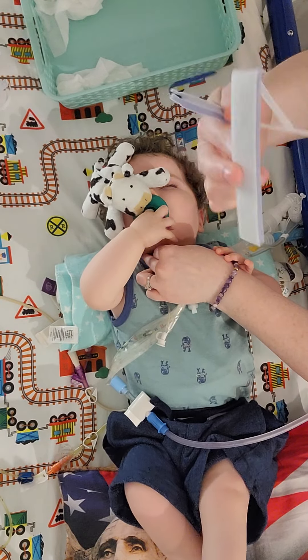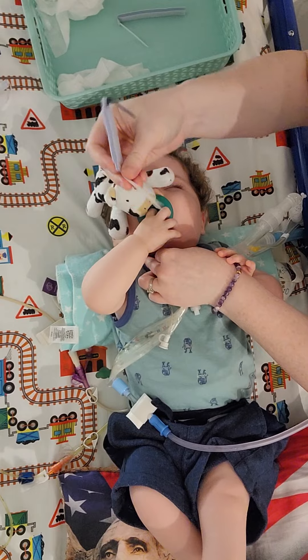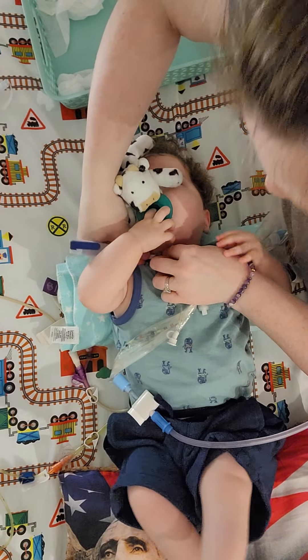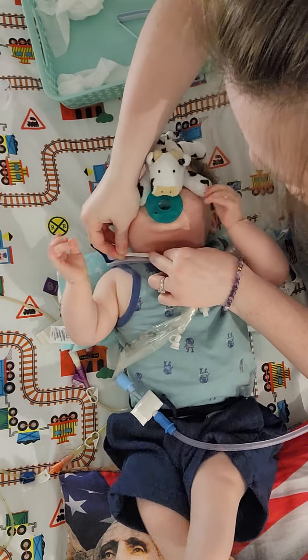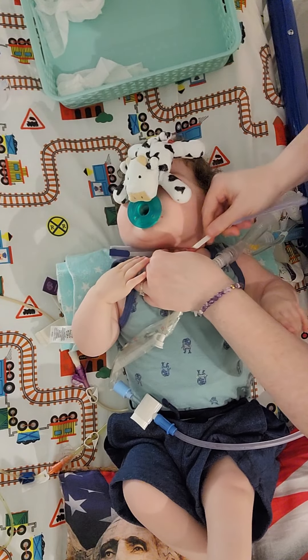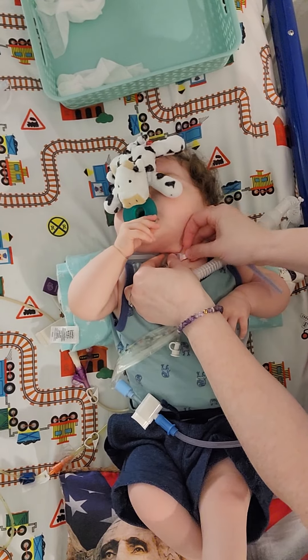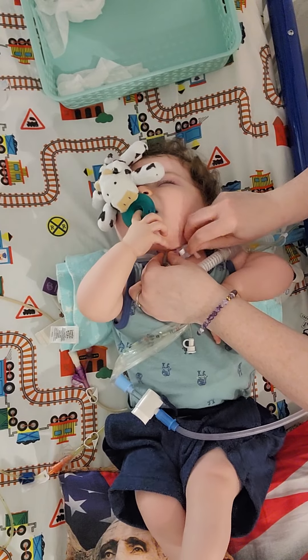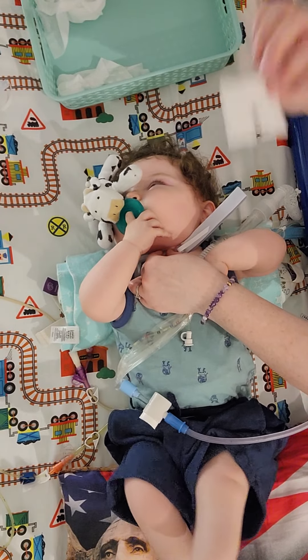Now the tricky part. There are two sides of the trach ties — this is the shorter side that you did not cut. I use Pepper Medical trach ties because they are my favorite; I actually get them from Trach Moms on Facebook because our DME does not supply these. On this side you thread it through the hole, but again, before you pull it through, put your finger underneath and pull it through with your other fingers, always protecting their neck — never pull the plastic through without your finger behind it.